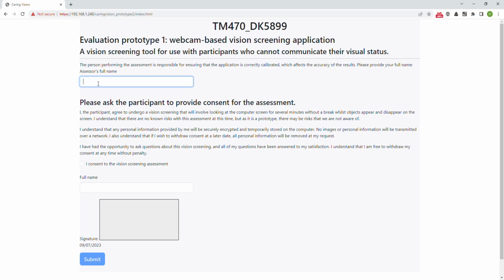The assessor needs also to fill out their details so we know who took the consent. So we're going to call them Mr. Assessor, and they have to consent, so they have to tick that I consent box, and then the participant fills in their details, and then we're going to call them Mr. Participant, and then they're going to sign the form, and we're going to sign. There we go, that'll do. So now the submit button becomes active, so we now can submit.